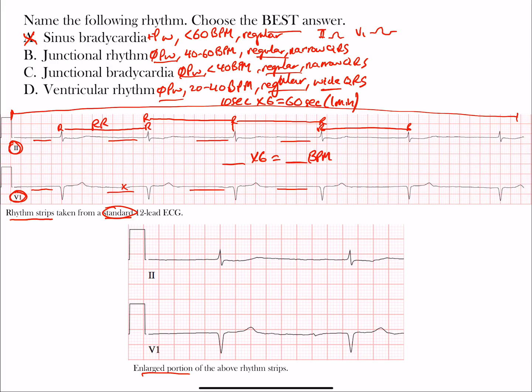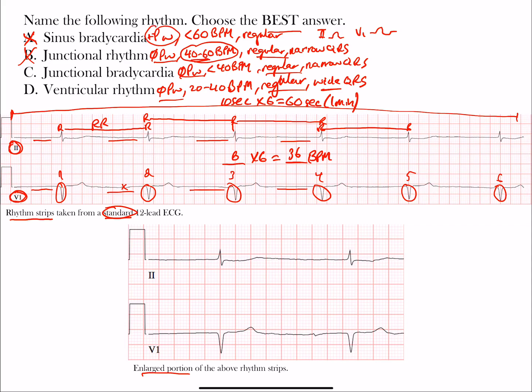Counting the QRS complexes: one, two, three, four, five, six. So our rate is approximately 6 complexes times 6 equals 36 beats per minute. Knowing that, we can see that junctional rhythm — with a rate between 40 and 60 — doesn't meet that criteria and can be crossed out. It also doesn't meet sinus rhythm criteria, since there are no P waves.